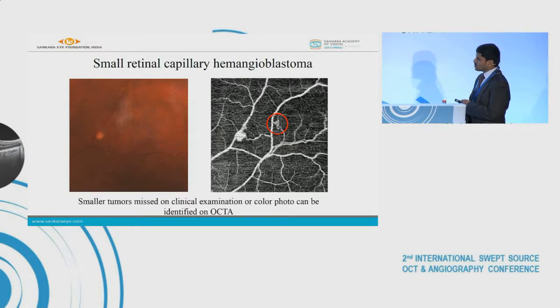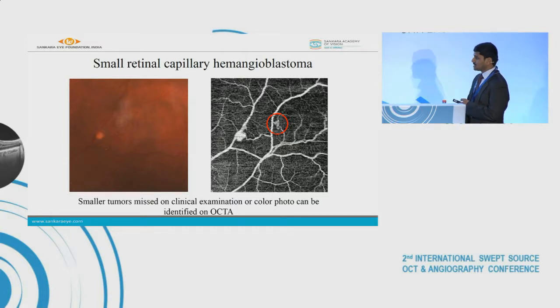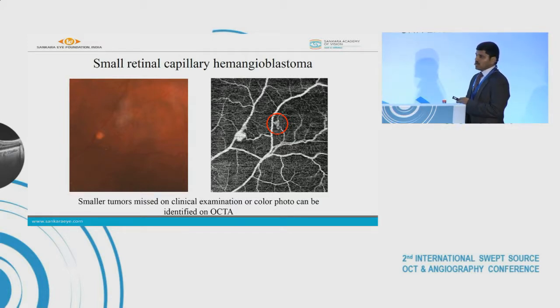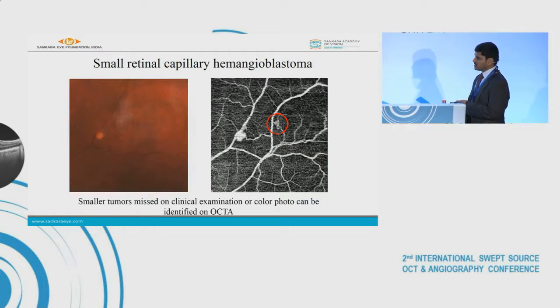OCTA can help in identification of smaller tumors which can be missed on clinical examination or color photography, but it has a limitation of only imaging the posterior pole, which will preclude its role to some extent.